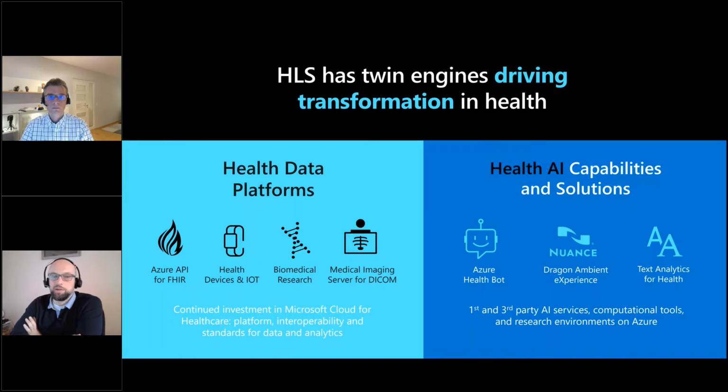It comes with standard guarantees for storing patient data. So basically, all you need to do is spin up the service within Azure and use the APIs which are compliant with the standard to store your data.